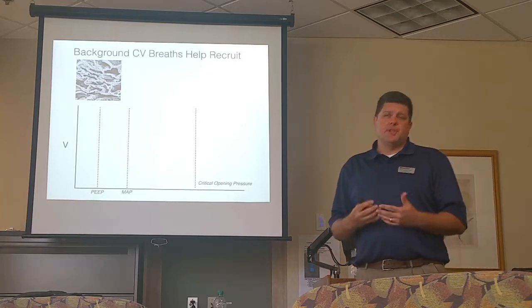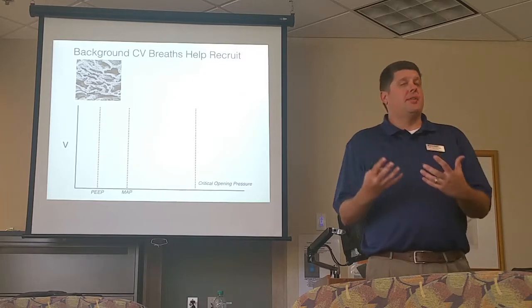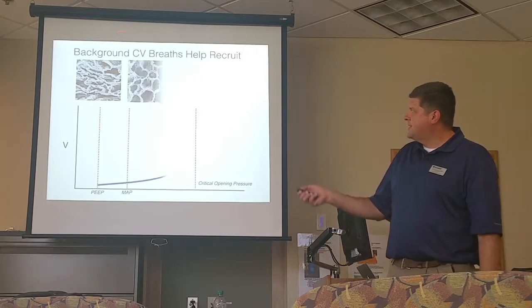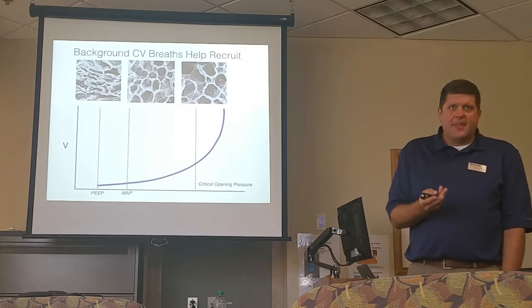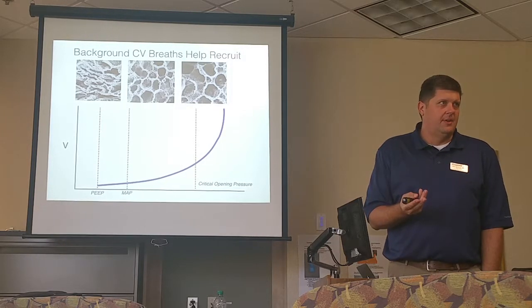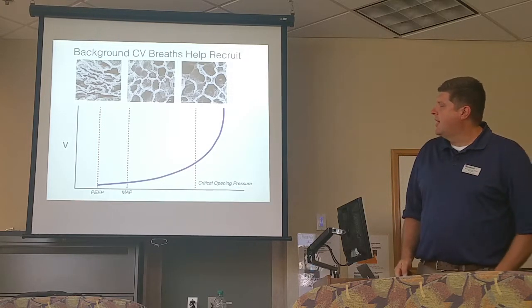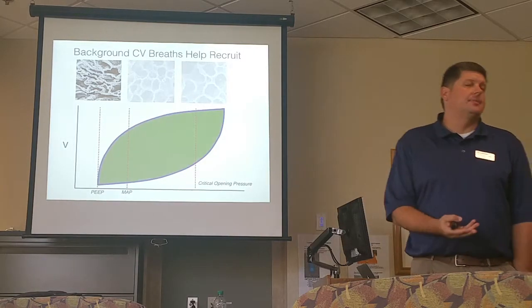But here's the beauty of using the conventional ventilator. There are things that you can do with big volumes and big breaths that you can't do with high frequency breaths, like recruit atelectasis. When you have atelectasis and you apply pressure, you've got to get past the critical opening pressure to pop open the alveoli. That's something high frequency will never do. It's too weak, it's too gentle. Remember, the lungs see less than 10% of what's actually dialed in. So that's where we supplement with the conventional ventilator. And then, of course, you need to make sure you have enough PEEP on the tail end to prevent the collapse there.